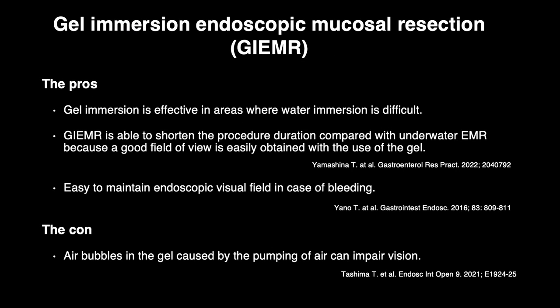Pros: Gel immersion is effective in areas where water immersion is difficult. Gel immersion enables shortening of the procedural duration compared with underwater EMR because a good field of view is easily obtained with the use of the gel. It is also easy to maintain the endoscopic visual field in case of bleeding.